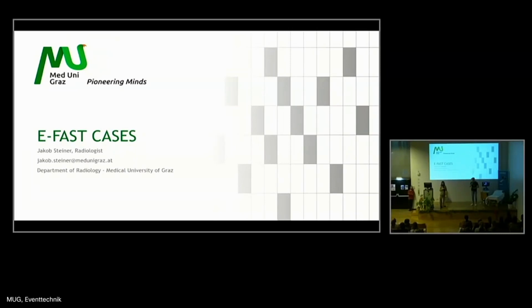Okay, so I guess that has been it. There is one more question from our online audience. The question is, when is it obligatory to perform a CT scan after eFAST? Sometimes, you have a radiologist point of view and you have a traumatologist, anesthesiologist point of view. But mostly we are okay with the decisions.